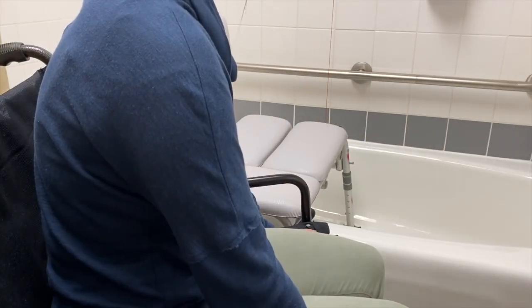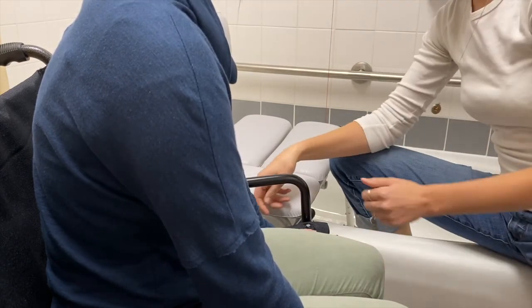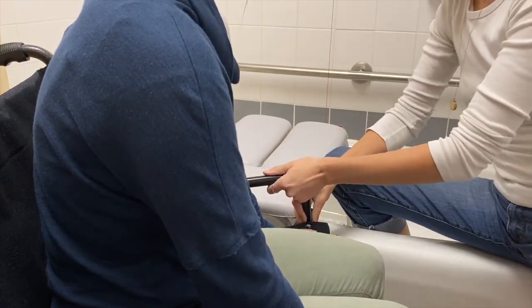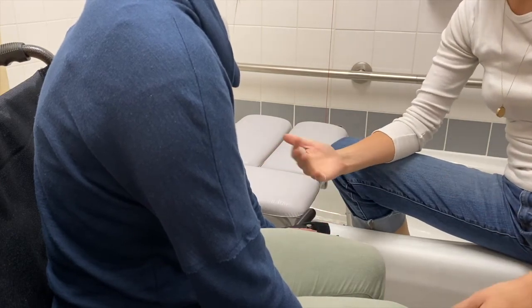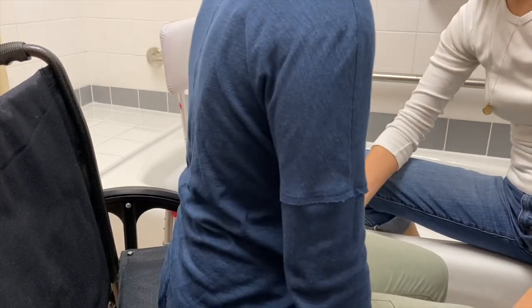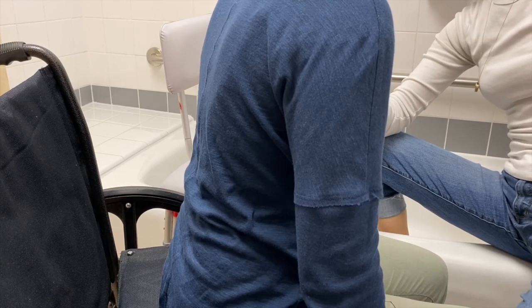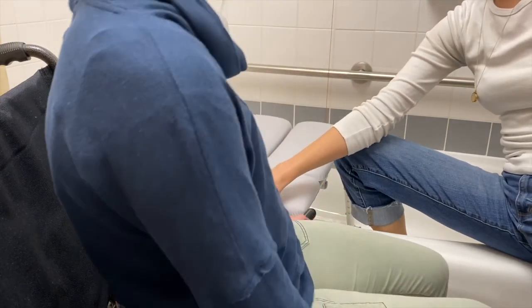From here, oftentimes I'll see clinicians try to give support from behind, but you're at a mechanical disadvantage. So I'll get my clinicians to come forward to either side-saddle the tub or actually sit inside of it to then do the transfer over. If she's doing a squat pivot or a slide board, I'm going to get this armrest out of the way. I'm going to cue my patient to sit forward — assuming Kelsey can help some — I'll put my arms underneath and she's going to do a squat pivot over. When she does this, if it were an actual shower she'd be naked.